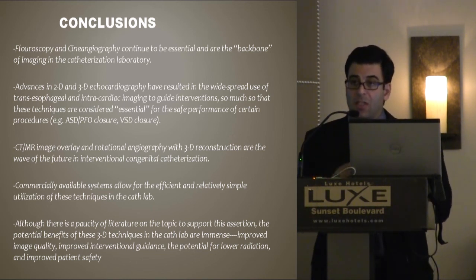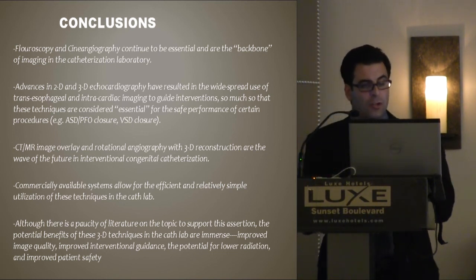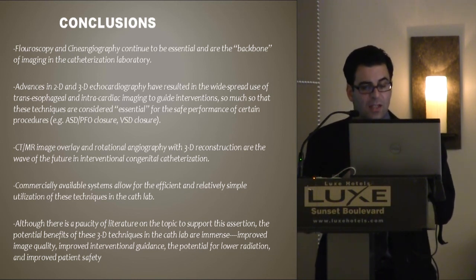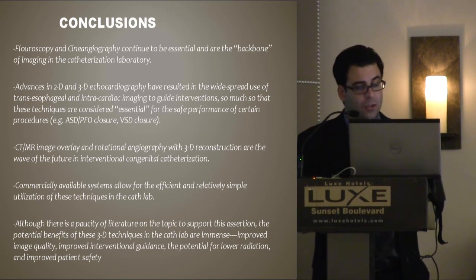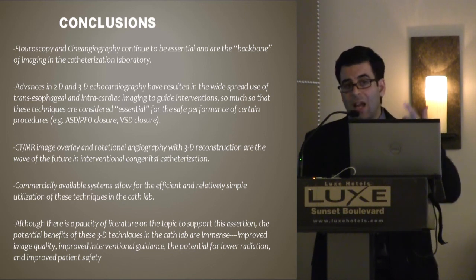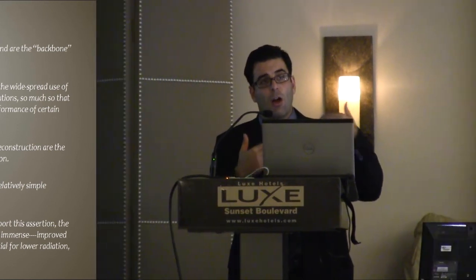There are commercially available systems now that will allow you to do that, but we still have a little bit of a paucity of literature here to support this assertion, but my assertion is that the potential benefits of these 3D techniques in the cath lab are just immense. Improved image quality, improved interventional guidance, the potential for lower radiation, and improved patient safety, not to mention the ability to teach a very complex field to our colleagues and actually show them images that make some sense.